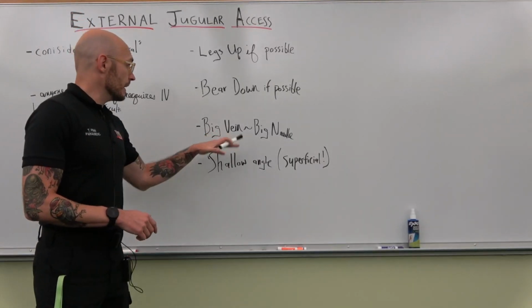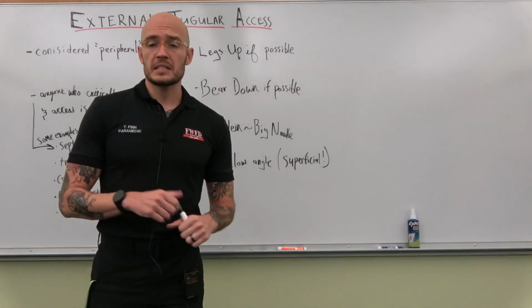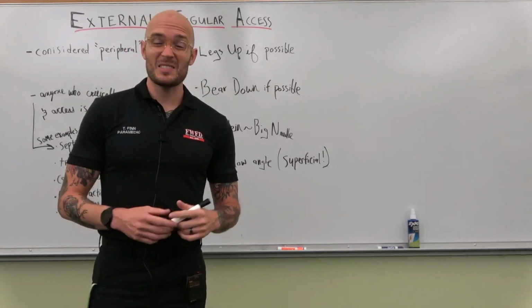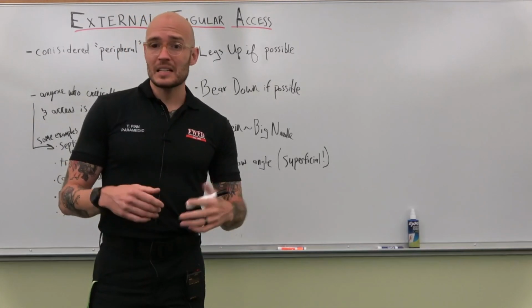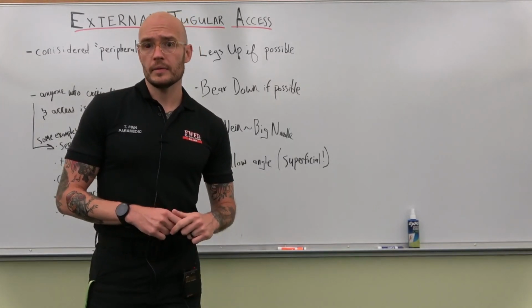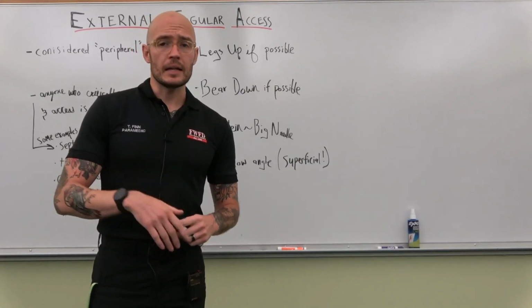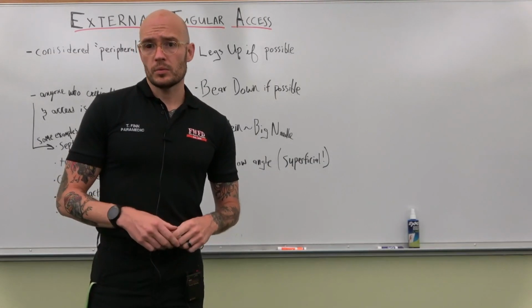This is a large vein, so you can use a big needle. I'm thinking 16s, 18s maybe, but 14, 16, those are going to be probably your bread and butter here, all right? So don't be afraid to go big, all right? Again, this is a sick patient, they need it, and you can be aggressive with this.